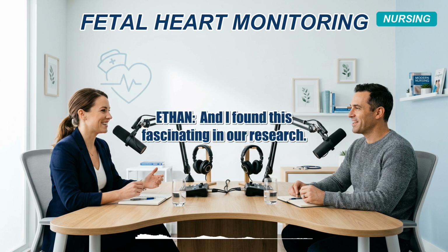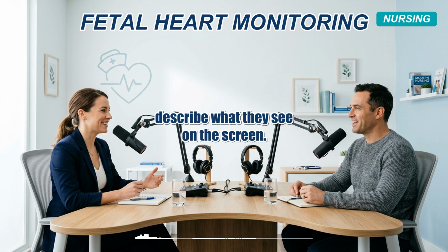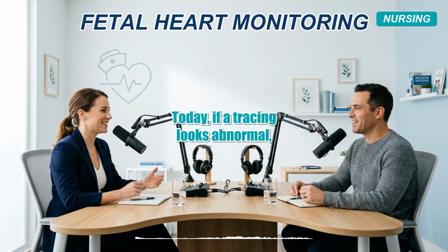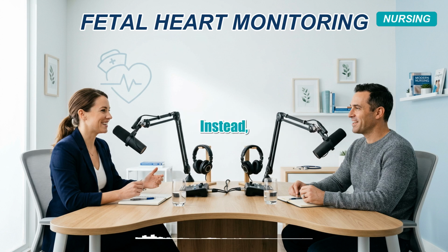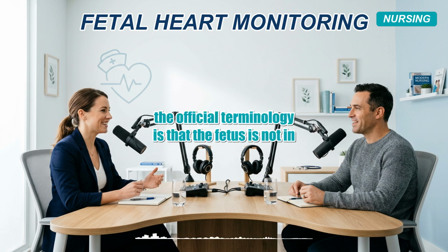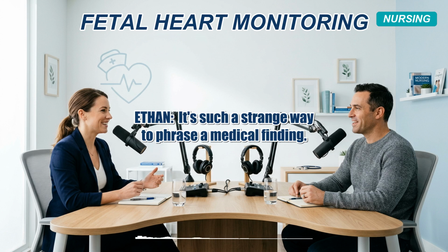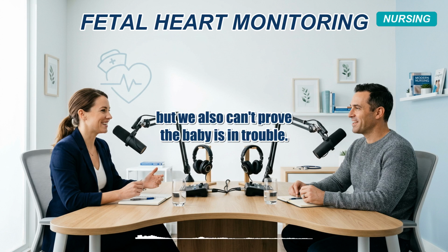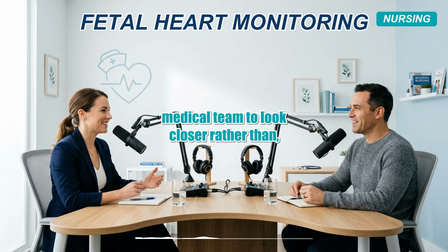And I found this fascinating in our research. The medical community now uses this bizarre double negative to describe what they see on the screen. The phrasing is very deliberate. Today, if a tracing looks abnormal, a clinician won't say the baby is definitively in danger. Instead, the official terminology is that the fetus is not in a reassuring metabolic state. It's such a strange way to phrase a medical finding. I mean, it's like saying, well, we can't prove the baby is fine, but we also can't prove the baby is in trouble. Right. It essentially means the squiggly line is just telling the medical team to look closer rather than initiating an automatic emergency surgery.